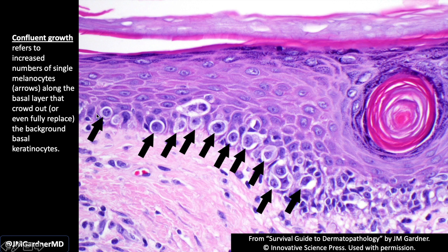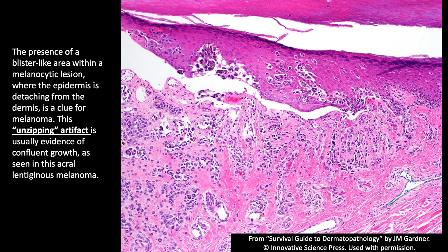This is an example of confluence where the basal layer of the epidermis is being replaced by melanocytes — especially with numerous atypical ones like you see here. In practice, though, confluent growth is easy to talk about but actually quite challenging to evaluate. It's not usually as straightforward as this, so while I'll teach you the feature, I want you to know it's really difficult to assess unless it's really dramatic, like in this case.